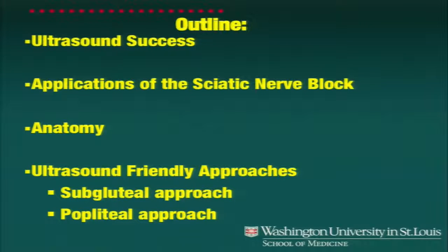The outline for this talk: we're going to talk about principles of ultrasound-guided success, the applications of the sciatic nerve block, as well as some applied, gross, and sonographic anatomy. We're also going to talk about two distinct approaches to the ultrasound-guided sciatic nerve block, the subgluteal approach, as well as the popliteal approach, mainly the lateral popliteal approach.